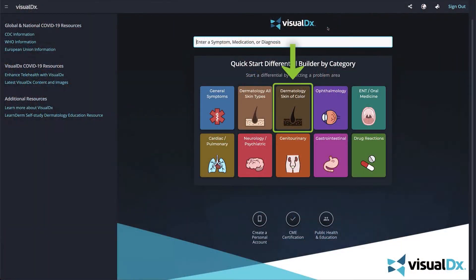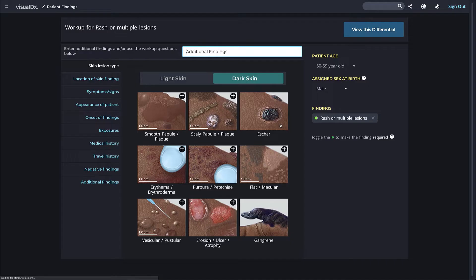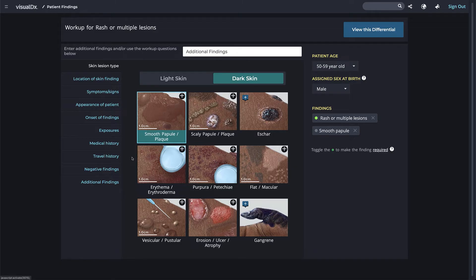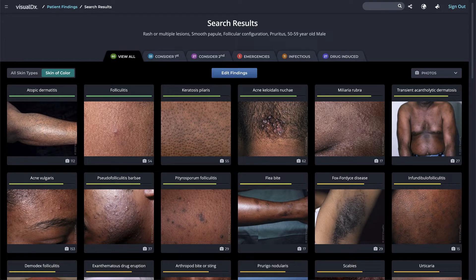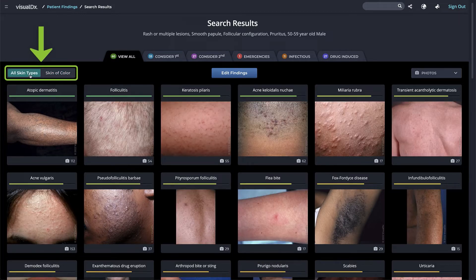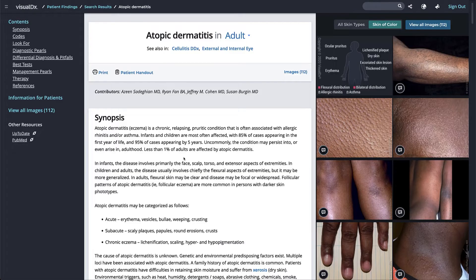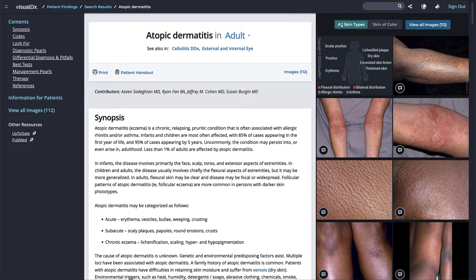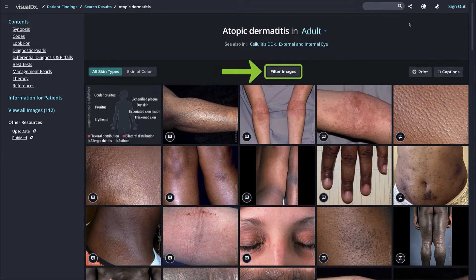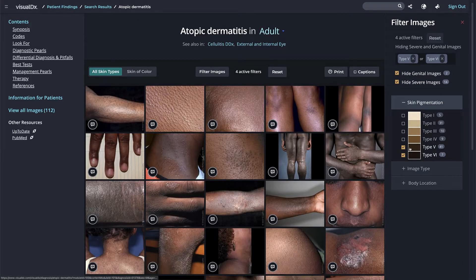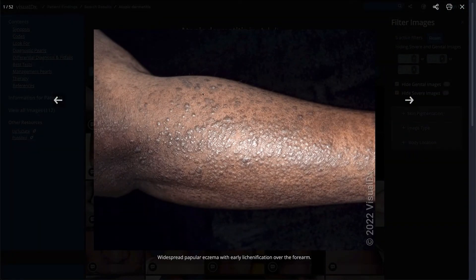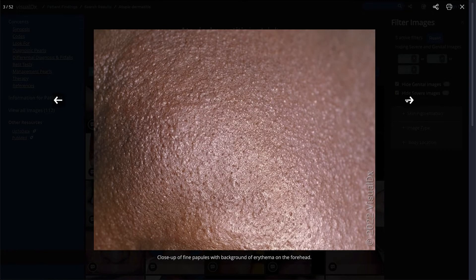VisualDX is committed to equity in medicine and improving care for patients with skin of color. On the home page, click on Dermatology Skin of Color to begin building a differential diagnosis. Notice the lesion types display in darker skin tones. Once you enter your findings, your differential diagnosis shows dark skin images first. However, you can easily toggle between skin of color and all skin types. Once you are viewing a diagnosis page, the images are also sorted to display skin of color images first. Share the images that resemble your patient's presentation to help build confidence in the diagnosis and improve patient satisfaction.